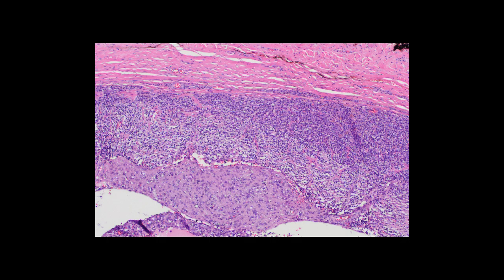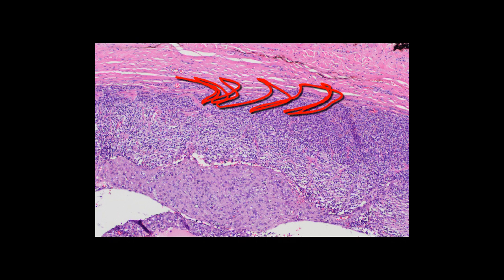Moving to the periphery, you can appreciate this dense lymphoplasmocytic cuff and the surrounding dense fibrous pseudocapsule. Note that despite the low power similarity to a lymph node, there is actually no subcapsular sinus, which is a useful feature in helping distinguish these from lymph nodes.